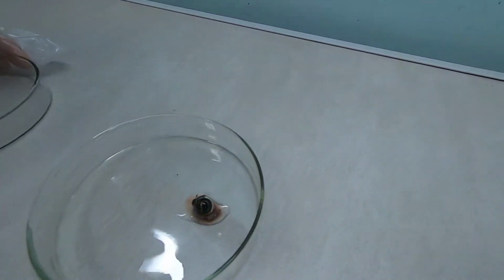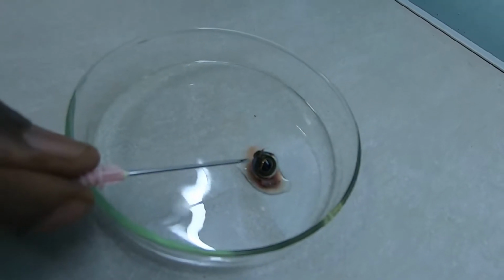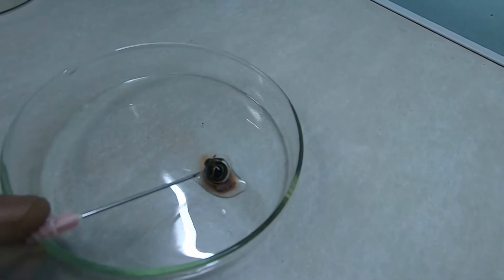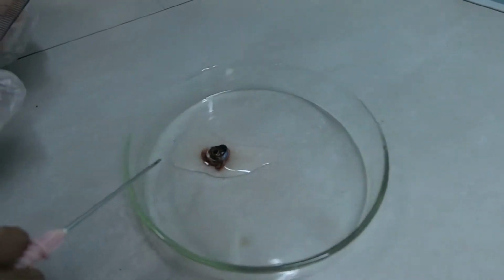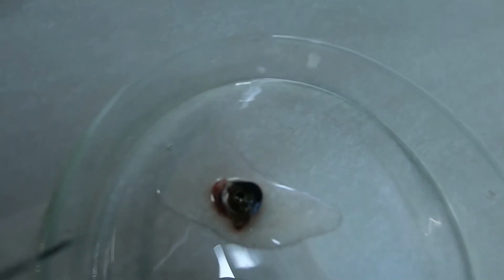So, dear students, you can see where we have adrenaline, it is very, very big. It has widened, opened up. The pupil became wider, yes? Look, please. But here practically it doesn't change, where we have the solution of Ringer.